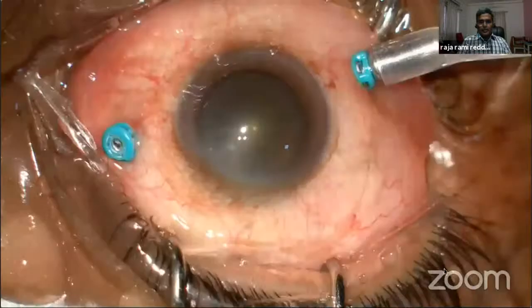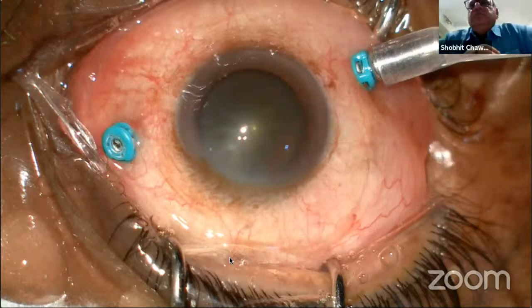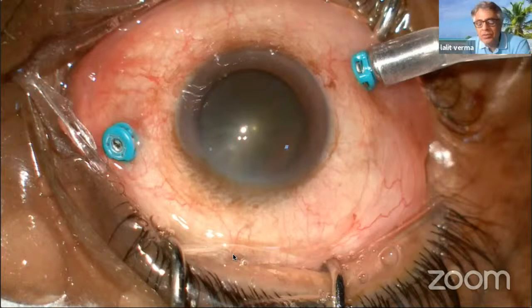Sir, like I said, I also use this spatula in all diabetics and in PVRs also sometimes. And I agree that it's blunt, with a blade which is angled, something akin to an iris repositor, and you use it very effectively. The beauty of the instrument is bluntness and finding a plane, so that ultimately you can remove it with the cutter. It does obviate bimanual surgery in a whole lot of situations without much damage. The main aim is to find a plane and do a blunt dissection without much damage to the underlying retina.